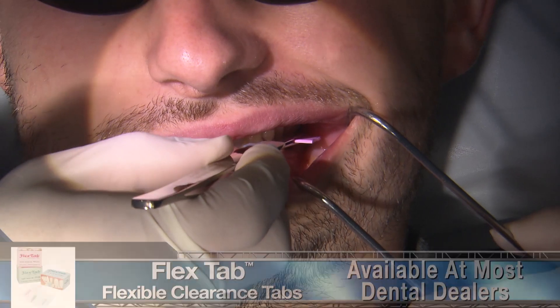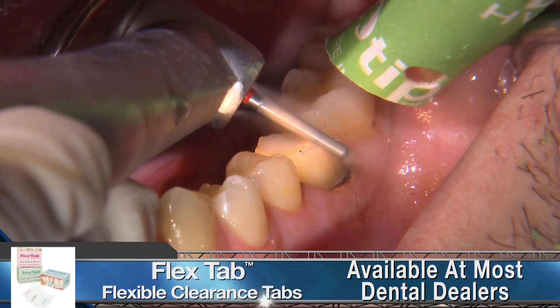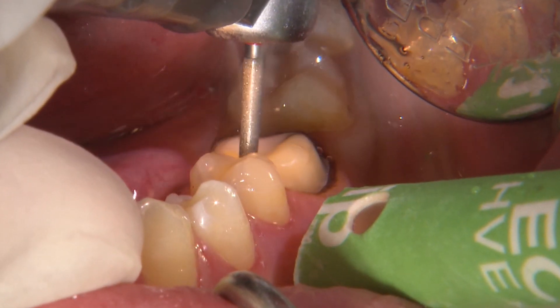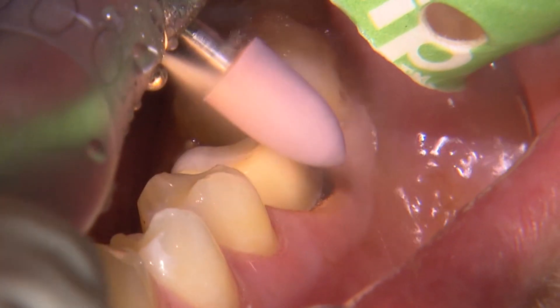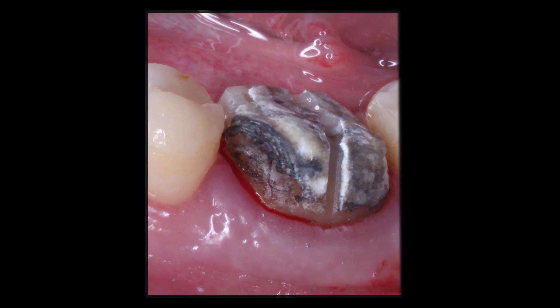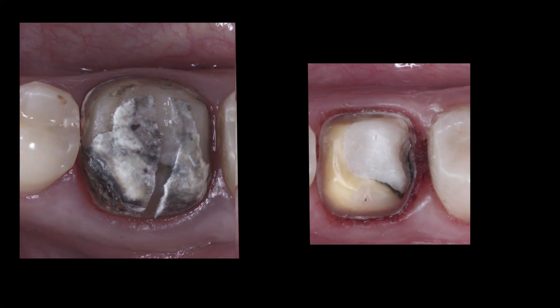Here I'm using Kerr's pink flex tab to verify that I've established at least one millimeter of occlusal clearance. For the final prep, I'm aiming to establish adequate axial reduction to create a sharp cavo-surface margin, adequate occlusal reduction for strength and ideal anatomy of the final restoration, and smooth and rounded internal angles so that we can have an optimal fitting restoration.